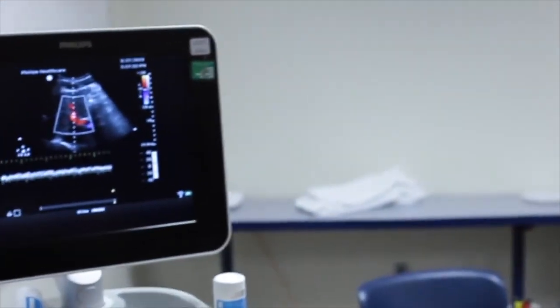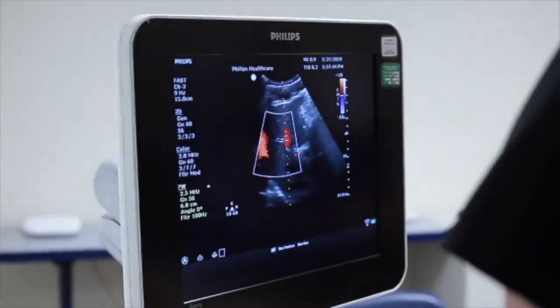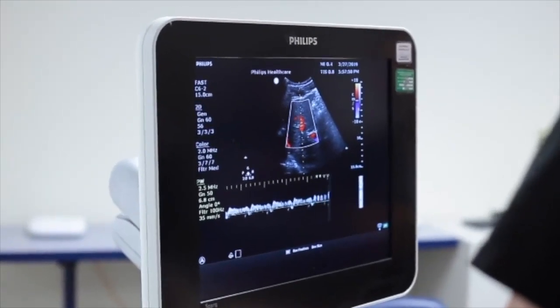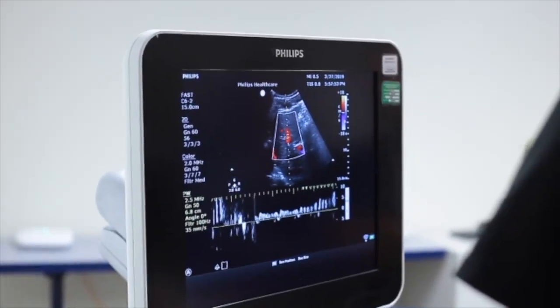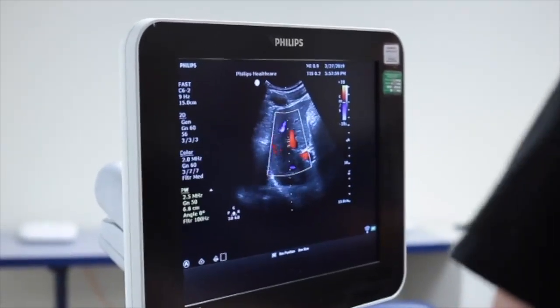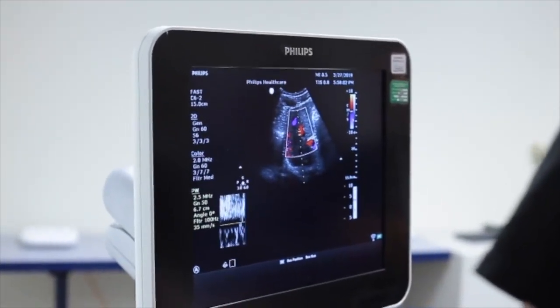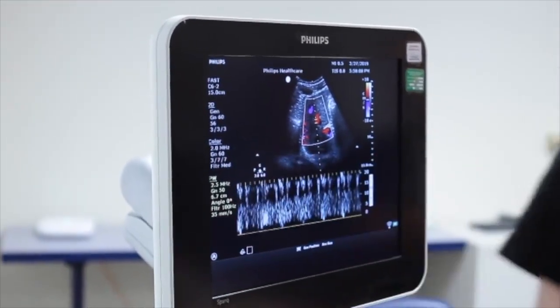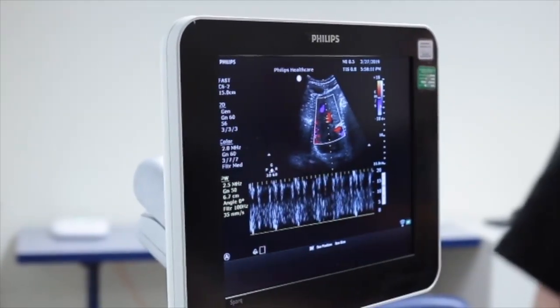And so you can see he's got a nice phasic, not pulsatile, thing going on, right? And if you want to make it a little more dramatic, you can put the pulse wave Doppler on and mess around with your scale. Back on the portal vein, we lose some of the density of it, but you could see more pulsatility if it was there, which it's not.